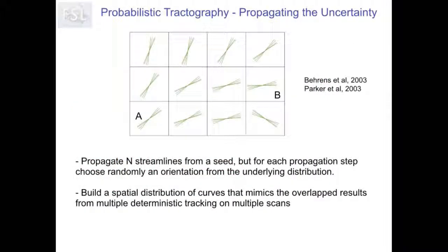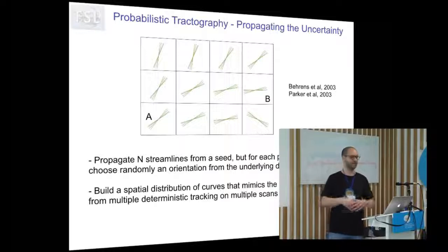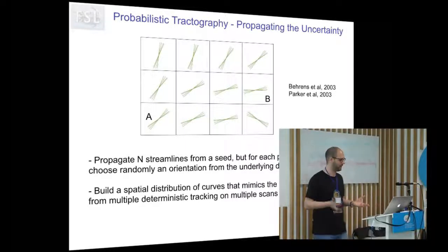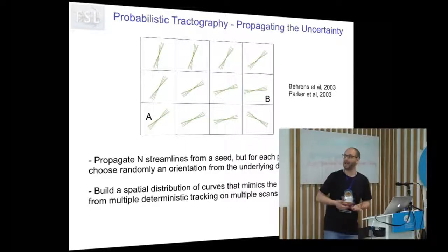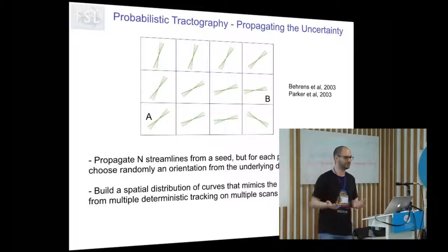More precisely, well, in a cartoon example, this is how probabilistic tractography actually works. This is a brain scenario that we can have out of a bedpostX analysis. We have a grid of 3x4 voxels, and in each and every one of these voxels, I have a distribution of sticks, a distribution of anisotropic compartments, right?